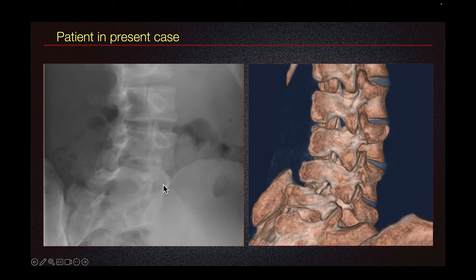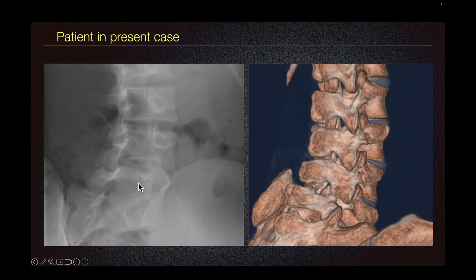Let's look at the radiograph. This is the nose, and this is the superior articular process. This is the neck, and we see the fracture of the neck. So this is a pars fracture.